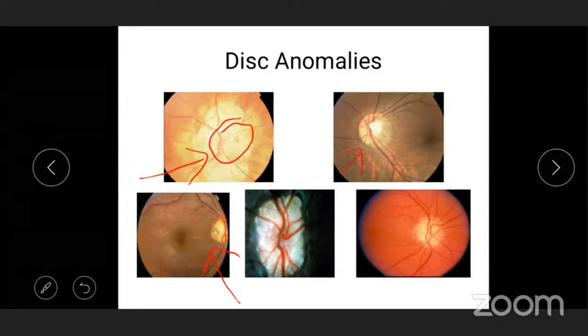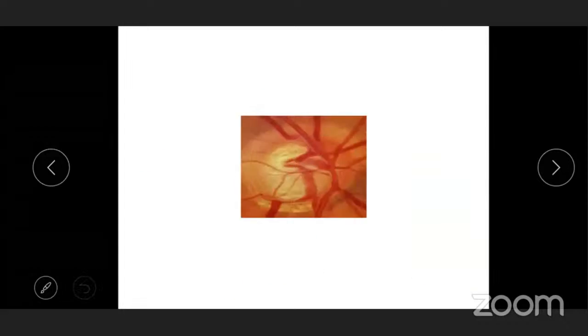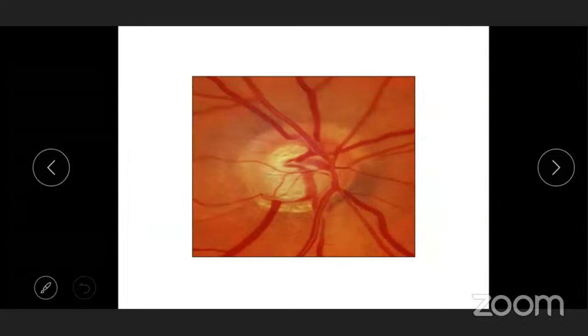It could still be glaucoma, but think of something else. If you look at it carefully, this was an optic pit. So if you keep that sequence in mind, and this was a sequence. Disc margin, I'll quickly repeat that.